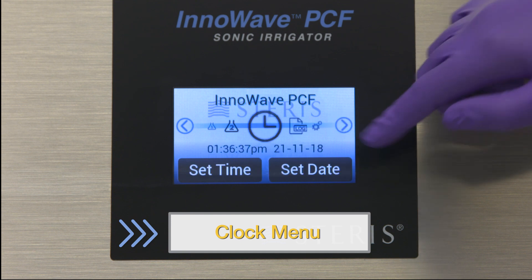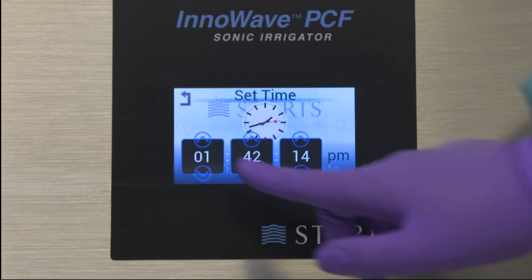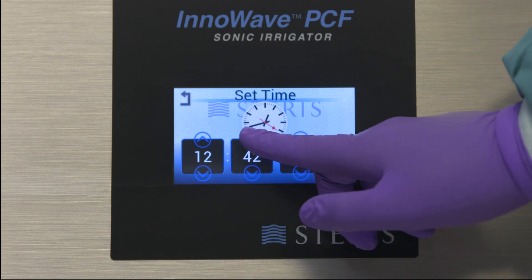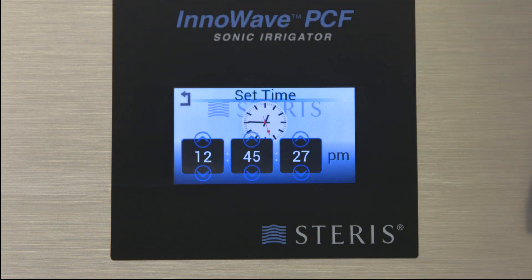Use the clock menu to set the time and date. Simply select the parameter you wish to change and use the arrow keys to change the values. Then press the back arrow in the top left corner to return to the main menu.